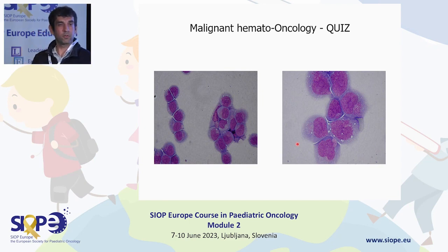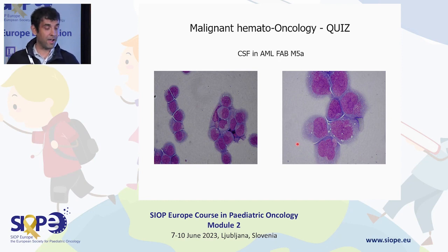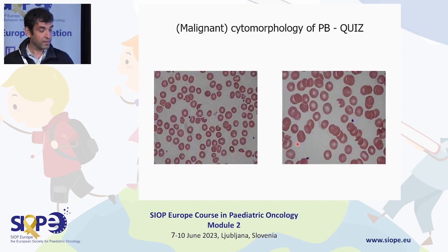Which myeloid leukemia often has extramedullary manifestations? And look at the cells. I have explained to you these cells already. Yeah. This was a patient with an AML M5. These are monoblasts. Often they have a KMT2A, or what we said before, MLL rearrangement.